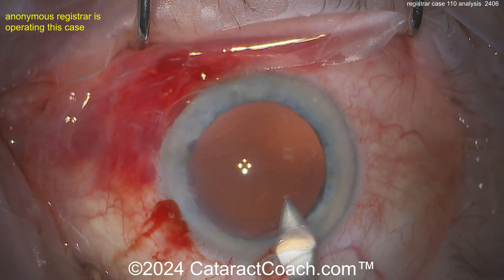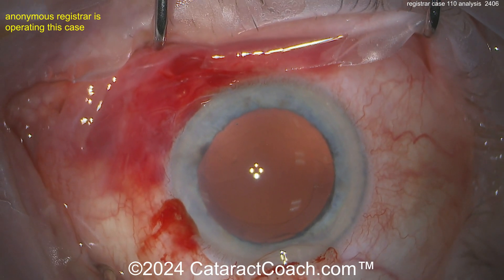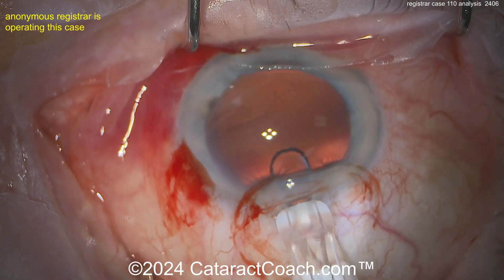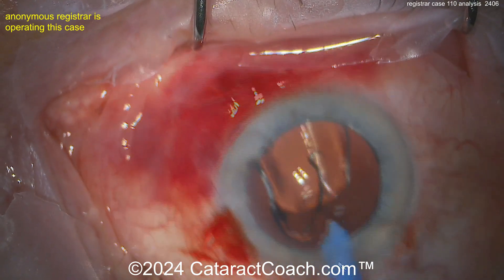Now enlarging the incision with the keratome. Let's see — putting the lens in. It should be a relatively routine case. If you're a doctor in training, I'm guessing it's a monofocal lens.